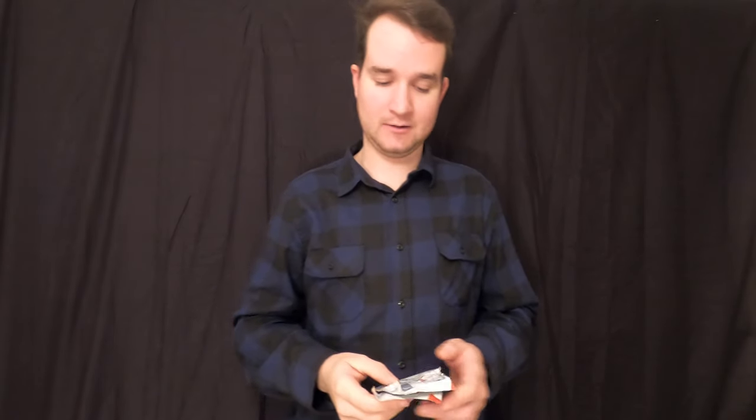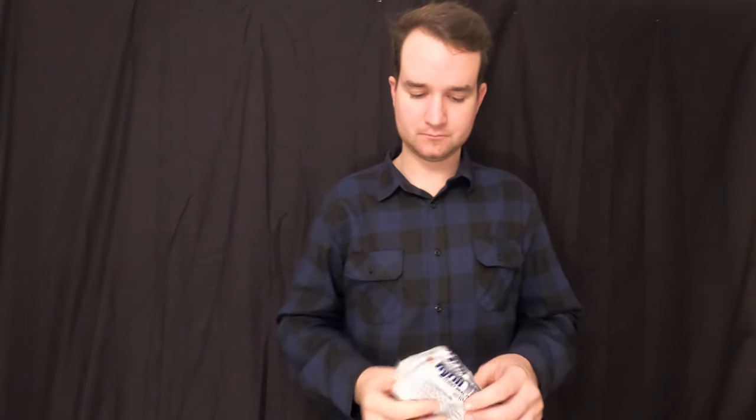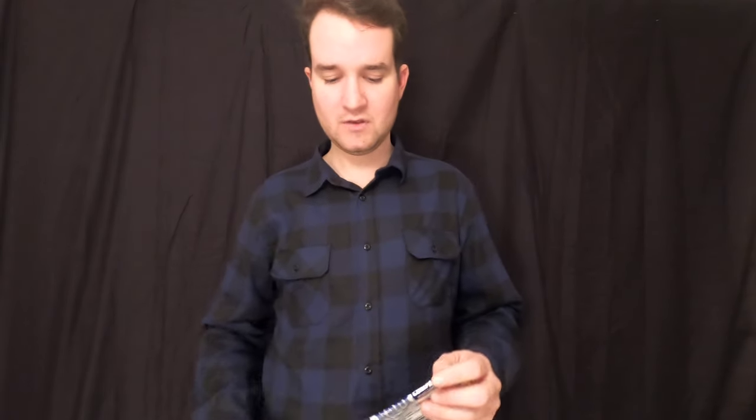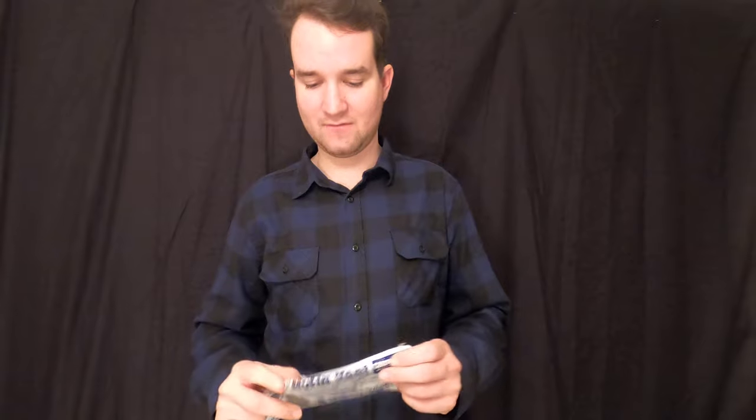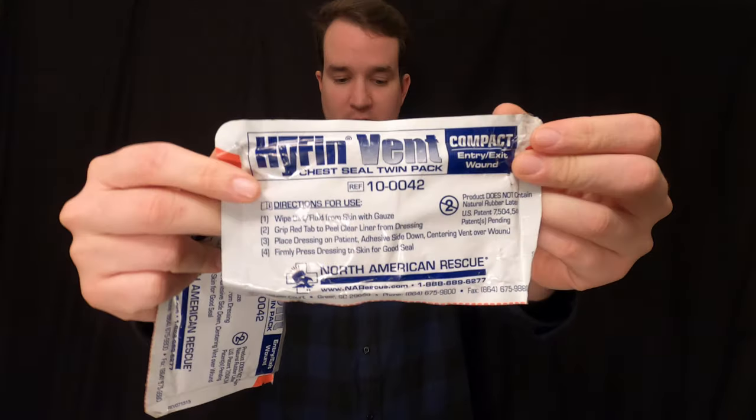But the vents are a nice added bonus to just a regular chest seal instead of having to seal it up some way and set it up so that you still have maybe an opening on one of the four sides so that air is getting out. So we have here our HyFin Vents from North American Rescue.